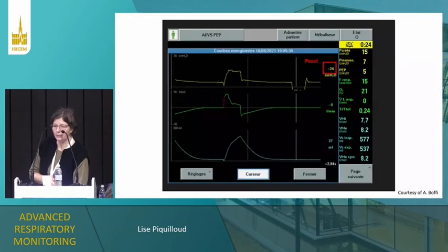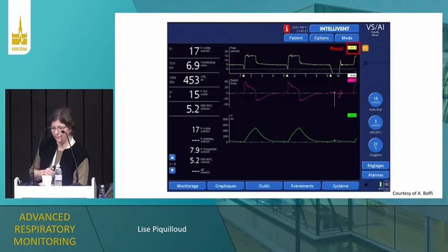Same thing here with another ventilator. Be careful, the total value is the minimal value plus the PEEP. It's the depression, the difference for occlusion pressure. And here with another ventilator, also the same.